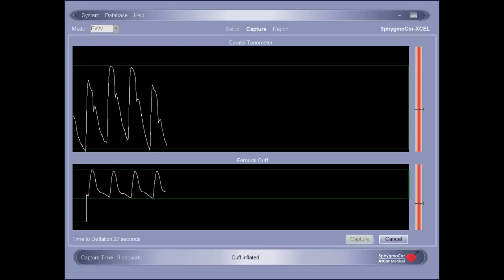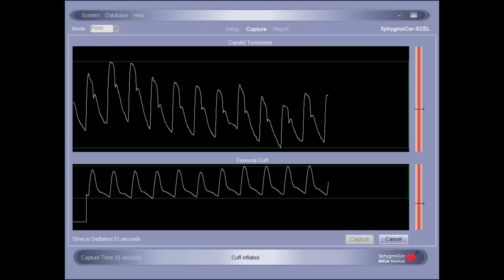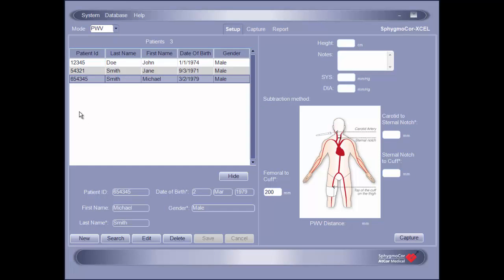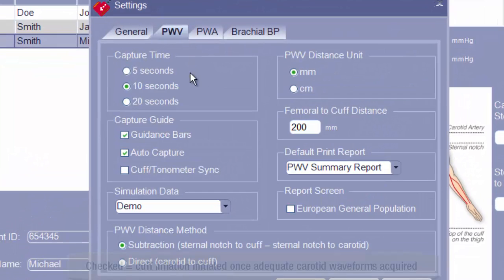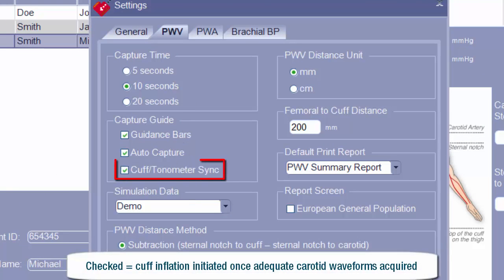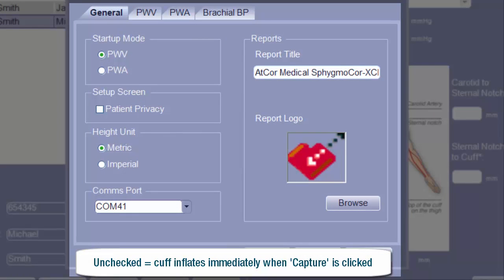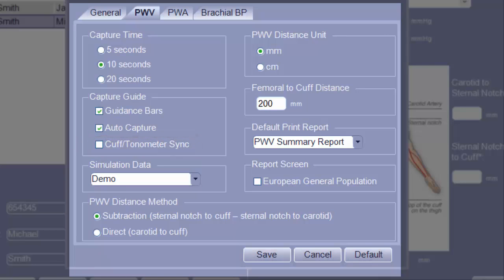When capturing waveform data for pulse wave velocity, the software provides two different capture settings, which are adjusted prior to beginning the assessment. The PWV settings options can be accessed by clicking System, choosing Settings, and then navigating to the PWV tab. When the cuff tenometer sync option is checked, the thigh cuff will inflate only after 10 seconds of adequate carotid waveforms have been acquired. When the option is not checked, the thigh cuff will begin inflating as soon as capture is initiated. In this tutorial, capture will be demonstrated with the cuff tenometer sync option unchecked.